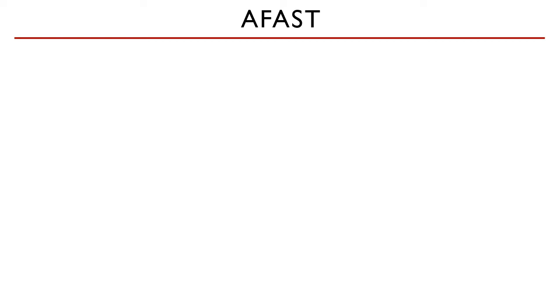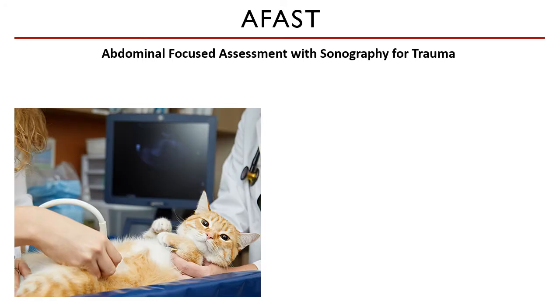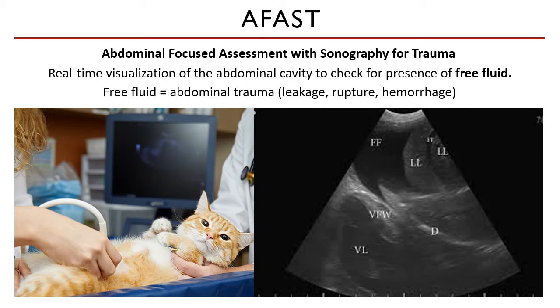What is AFAST? Do you still remember from our discussion on pre-operative assessment? AFAST stands for Abdominal Focused Assessment with Sonography for Trauma. This is a real-time visualization of the abdominal cavity to check for the presence of free fluid, as seen in this ultrasound image, with an initial of FF. Free fluid means there is abdominal trauma, which can range from a leak to a rupture of any hollow organs inside the abdomen, or an internal hemorrhage.